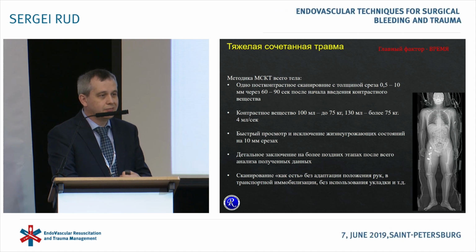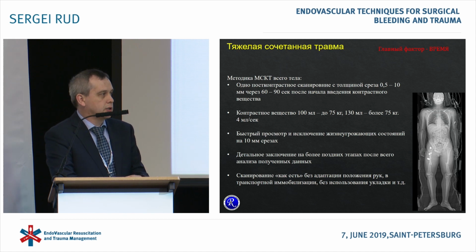Native CT is not necessary because it simply adds time, and only if there is high probability of a very severe damage to the brain, we have to carry out additional studies, additional CTs. For other patients, post-contrast study is carried out immediately.